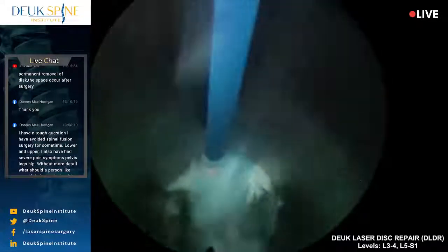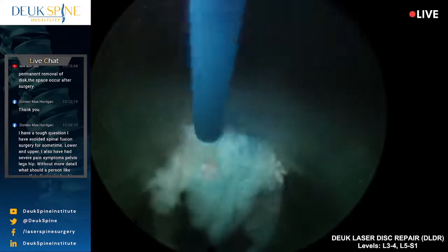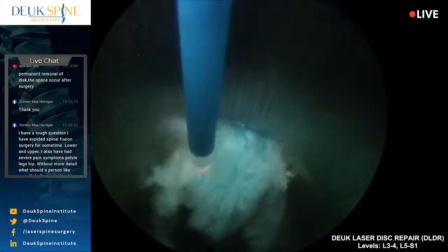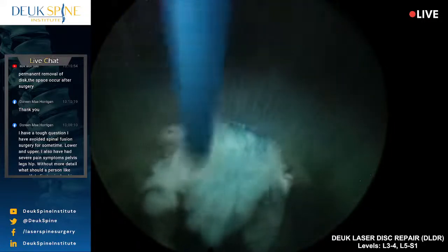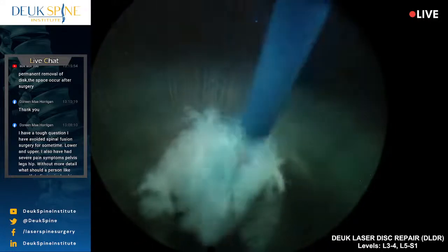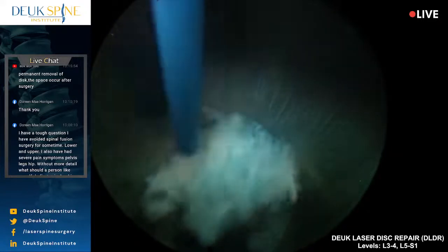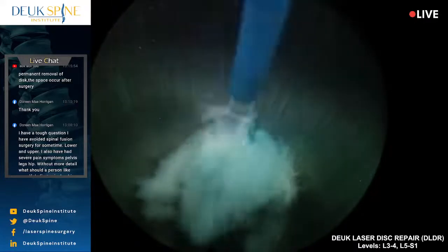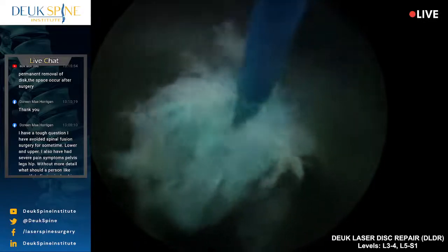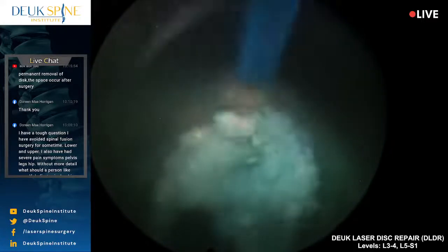And there's truth to that, right? So there's the tear right there. That blue stuff, the blue is the blue dye we put in. And that blue dye only binds to, only sticks to, only covers nucleus pulposus that is abnormal and degenerated. So think about that for a minute. If you see blue, it must be the jelly from the center of the disc. And look at this. This is stuck inside the annulus fibrosus. These white fibers are the torn annular fibers. And why is there nucleus stuck in there? Look at it right there. It's stuck in there, causing pain and inflammation. And that's what I debride, clean out, defeat, conquer.